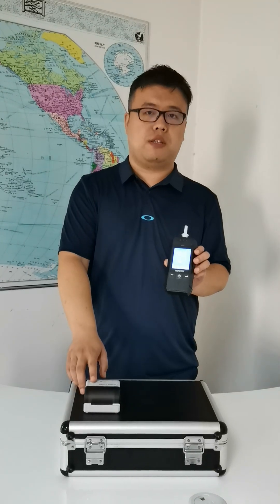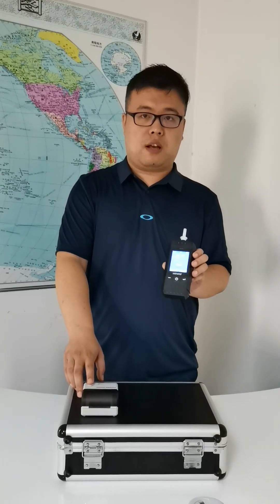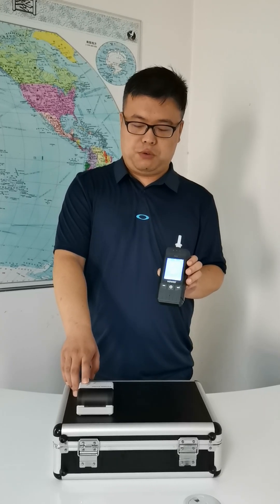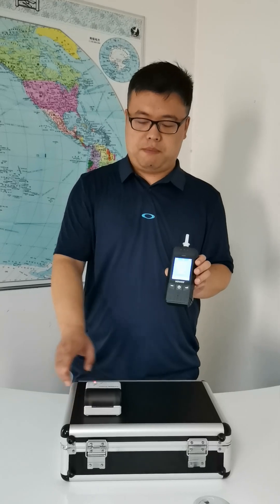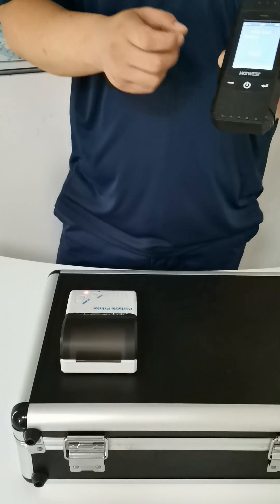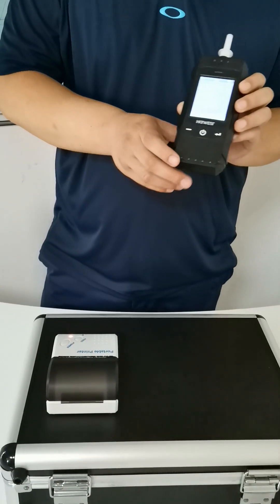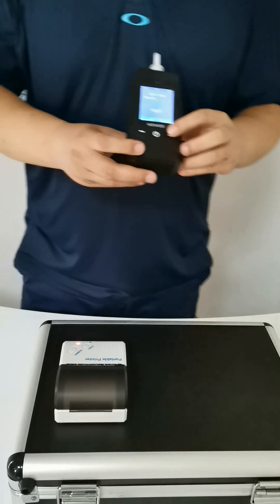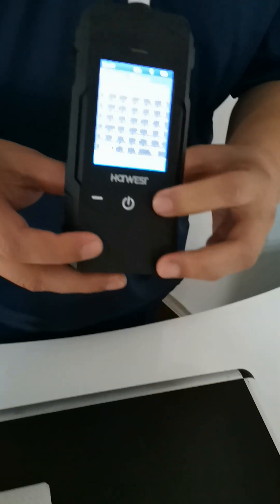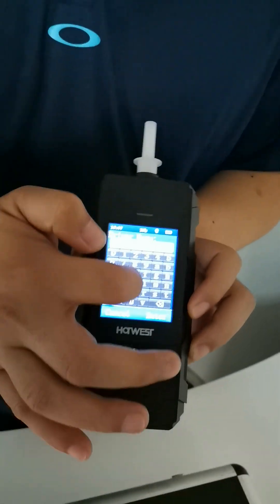Next I'm going to show how this one can also print the results using the thermal printer. First of all I need to start the printer — this is the Bluetooth connection. To print the results we need to enter the next step.